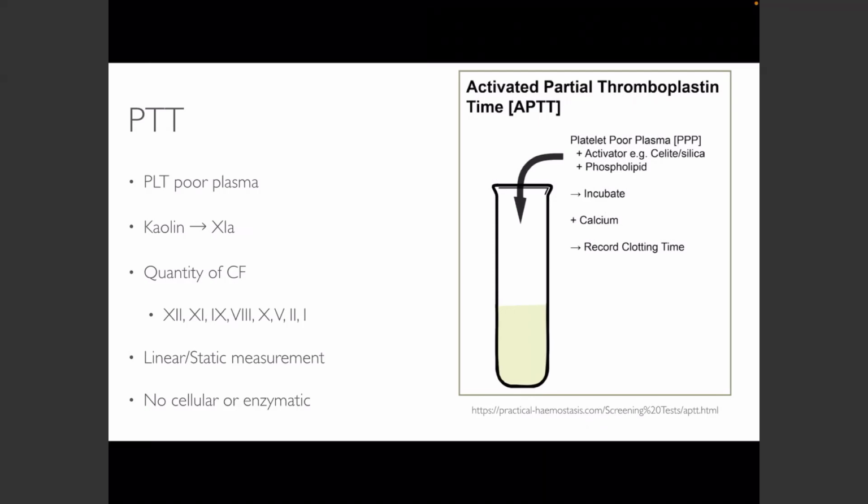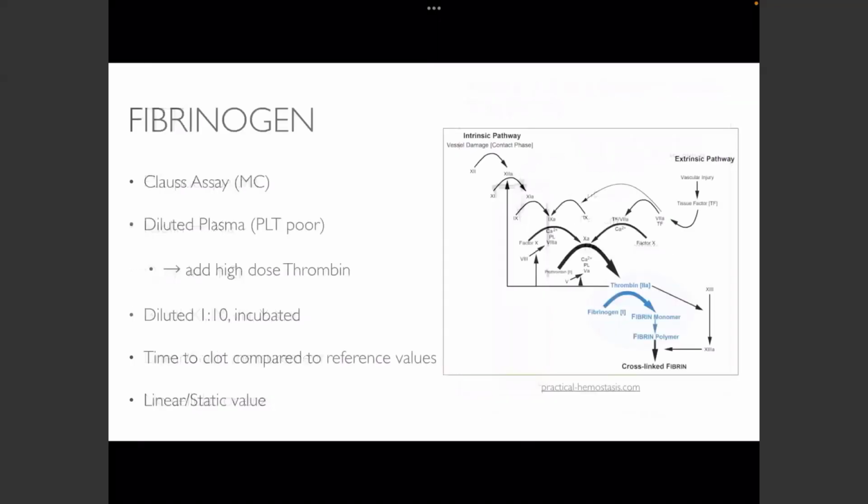But the big thing on these tests is it takes time. It's not a quick test, and that's one of the biggest disadvantages. This is also new information to me in terms of how it's actually run.